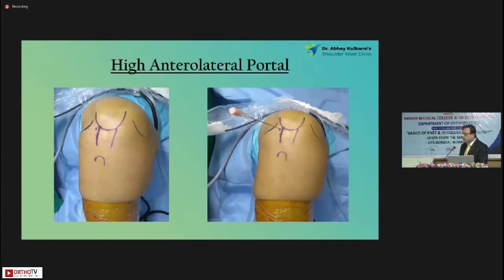The high anterolateral portal — I take a high anterolateral portal for all my knee arthroscopies. The position, as seen, is just inferior to the patella and as close to the patella tendon as possible. That's where the needle goes — that's my high anterolateral portal.